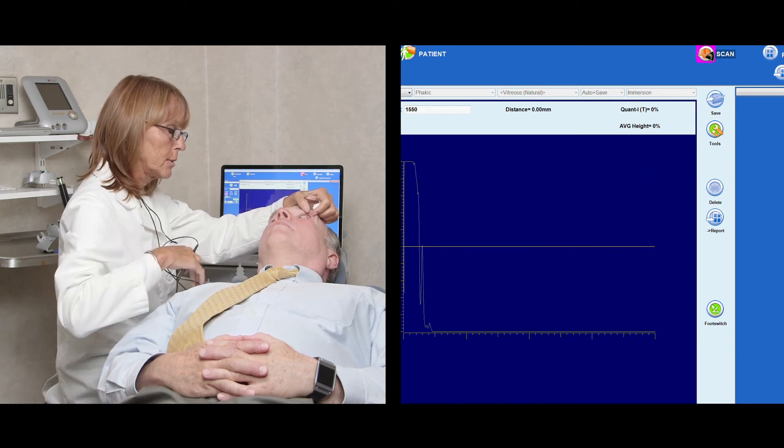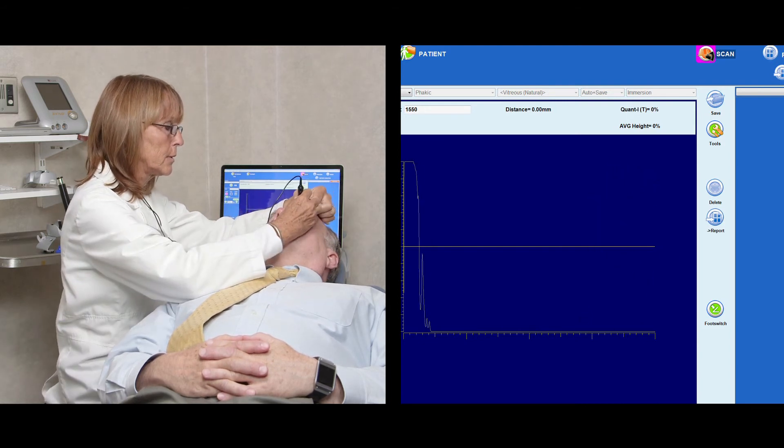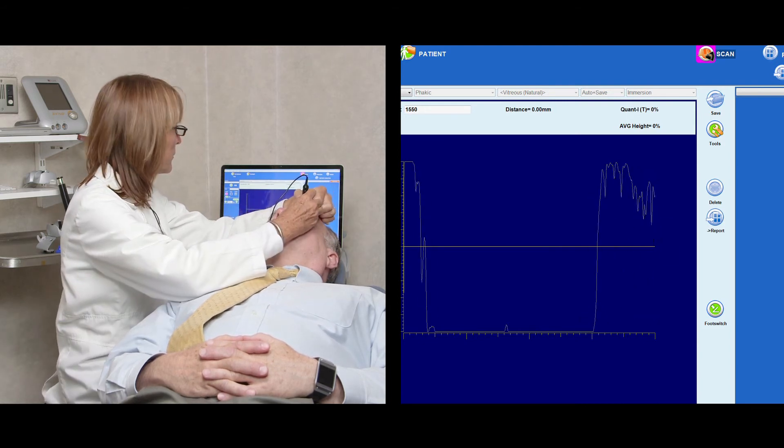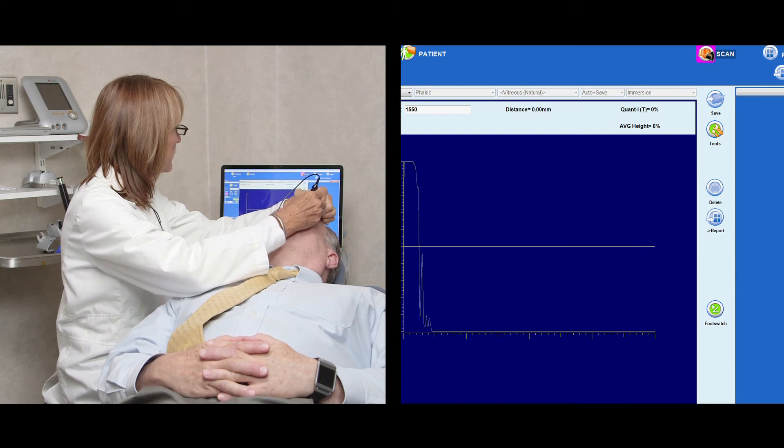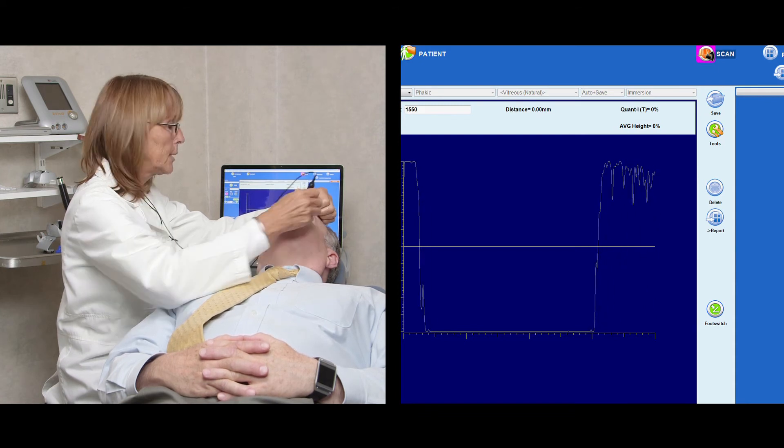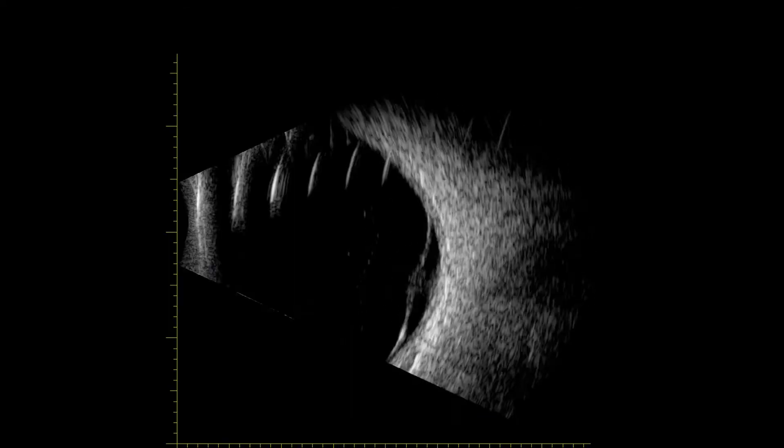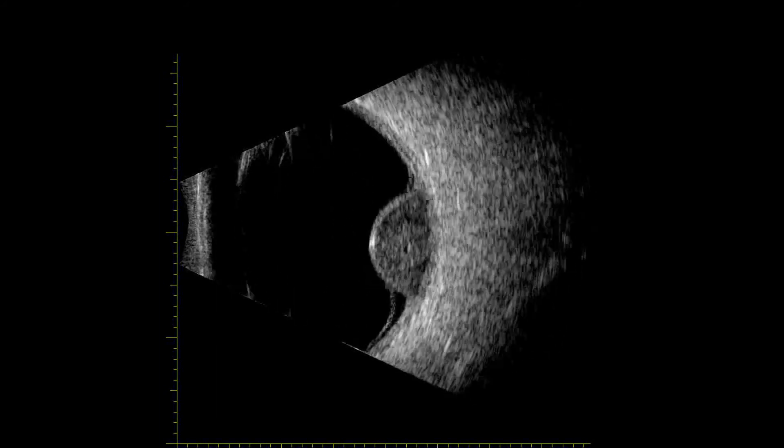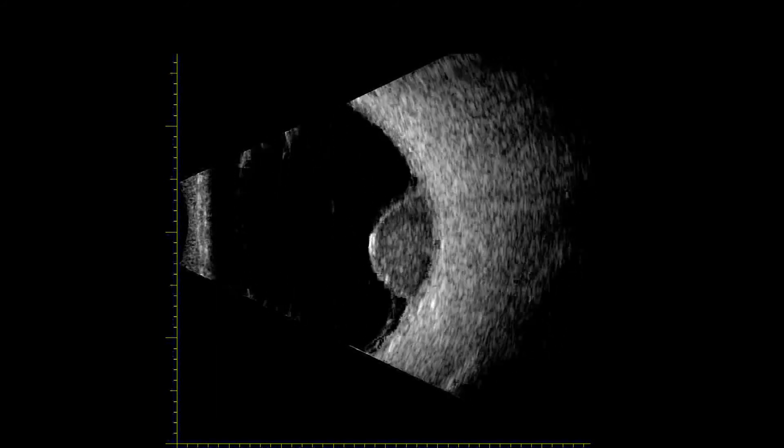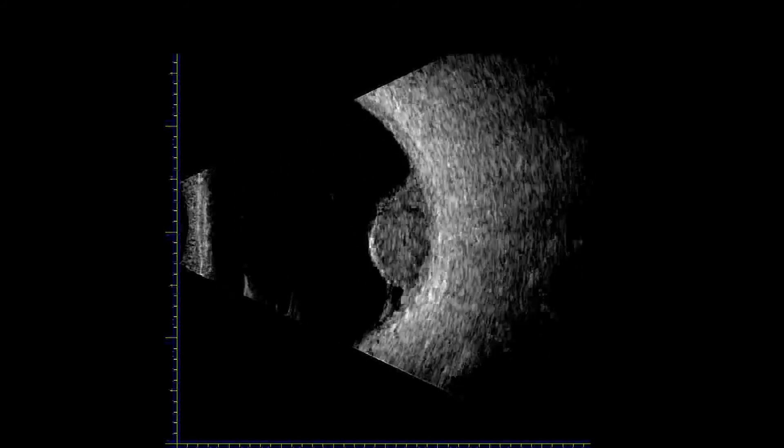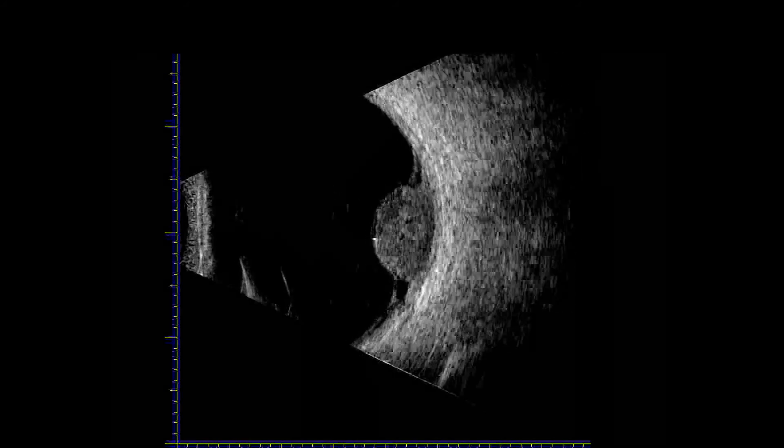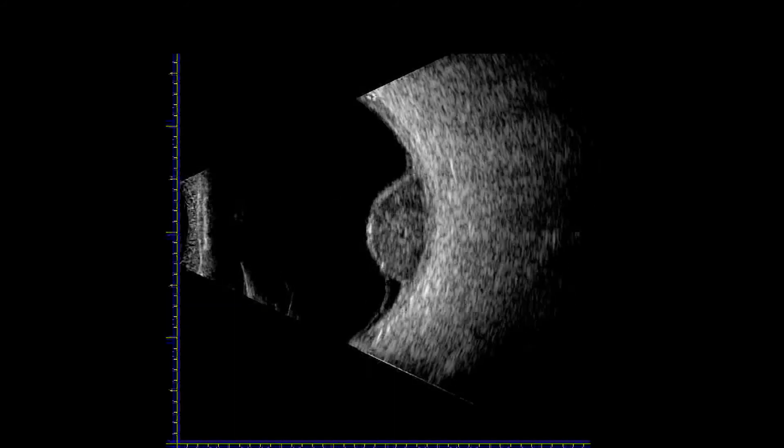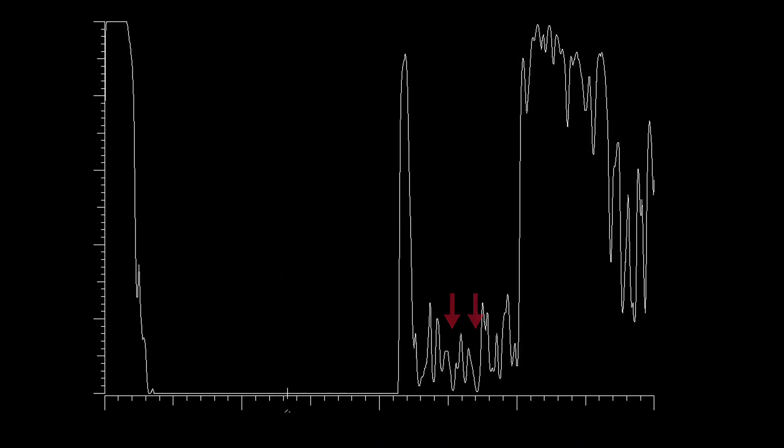If the size and spacing of the A-scan spikes remain the same regardless of beam direction, the lesion's internal structure is likely regular. The presence of vascularity in a mass can be apparent on B-scan if vessels are sufficiently large. But vascularity can also be detected or confirmed on standardized A-scan by looking for a rapid flickering motion indicative of blood flow in the valleys between spikes.